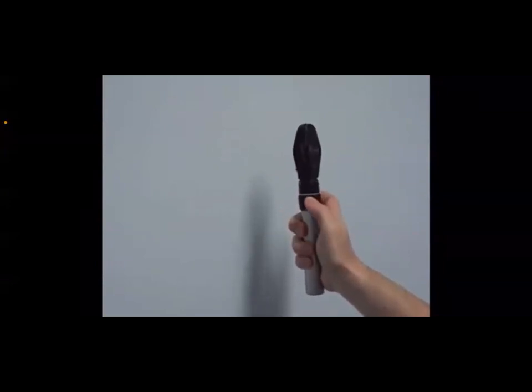Okay, so the light should not be too strong and should not be too weak. You should be able to see, but make sure that the light is not strong and it will not reflect back from the retina. Okay, so this is the first step in adjustment.